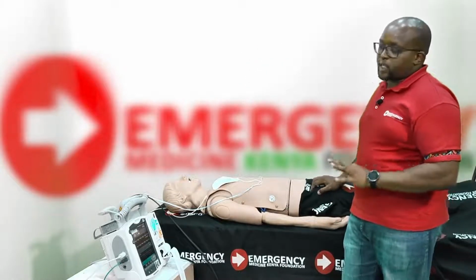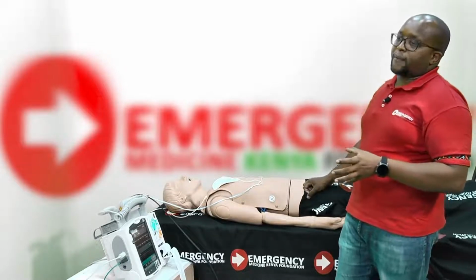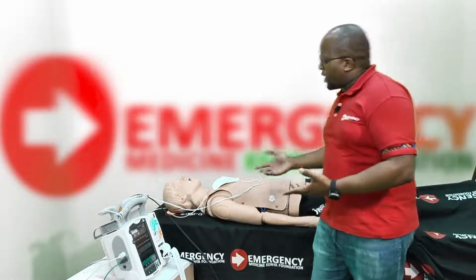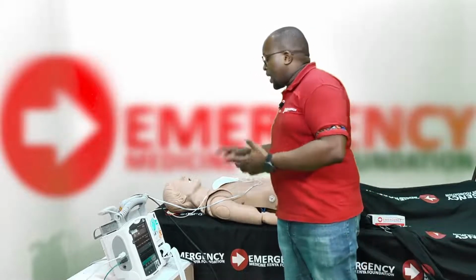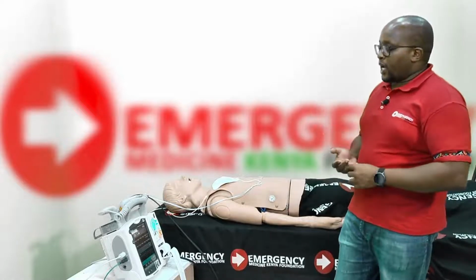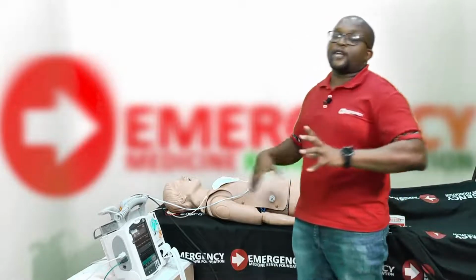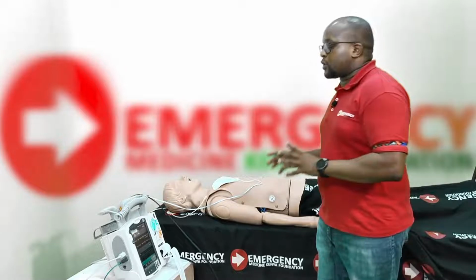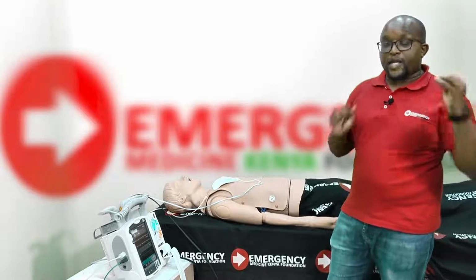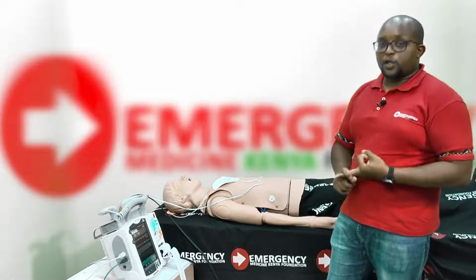Now, the third capture that we have to confirm is what we call physiological capture. Physiological capture is to make sure that we are now perfusing. So I will check my patient's blood pressure. Has it gone up? Are they now feeling nicely warm and perfused? Are they more alert, if the hypotension was causing altered mental status? The main reason I started pacing the patient was because the patient had features of shock. Physiological capture is to confirm that these features have now improved and the patient is much better. So I have three captures: electrical capture, mechanical capture, and physiological capture.